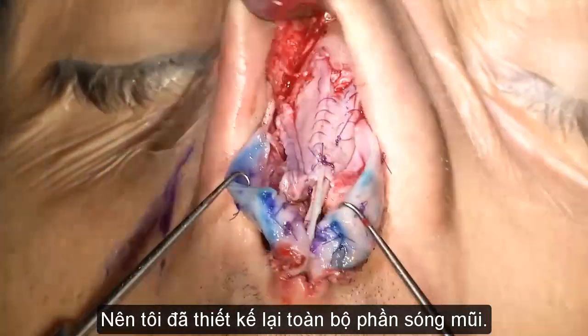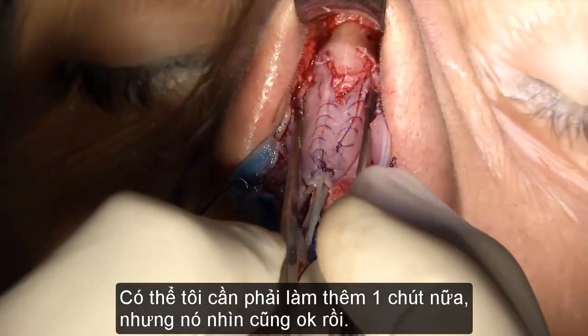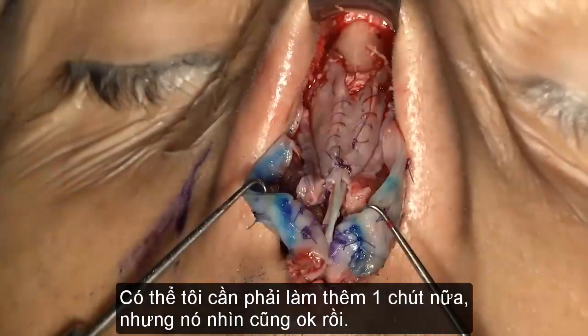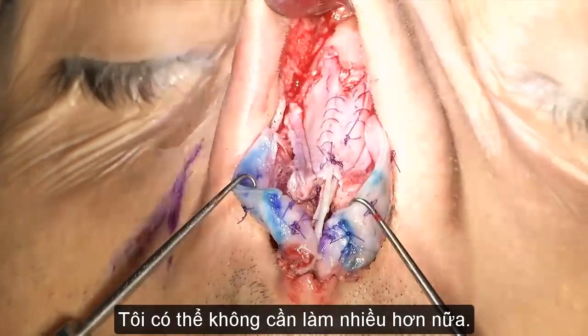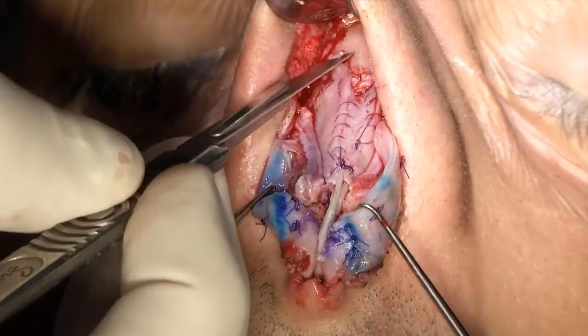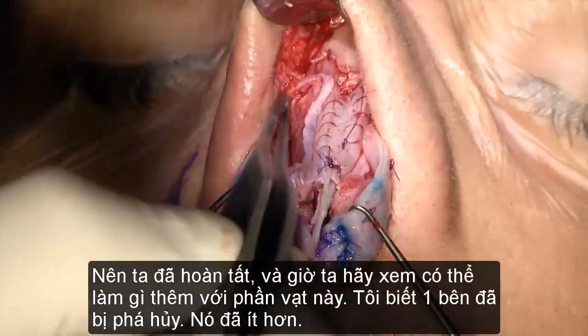So we redesigned the whole dorsum. Maybe I can take this a tiny bit. Nah, it looks okay. I don't really have to do much else. This thing is rather consistent. So having done this, let's see what we can do with these flaps.